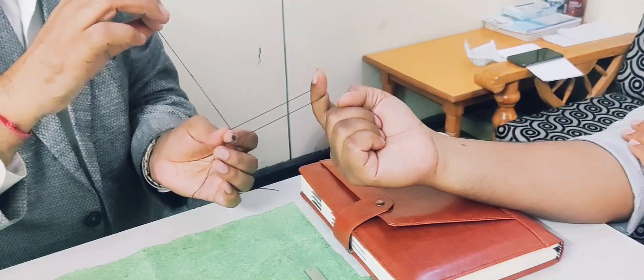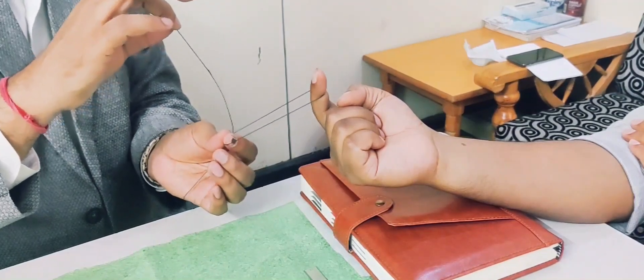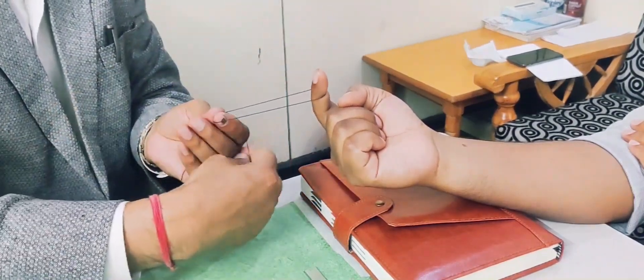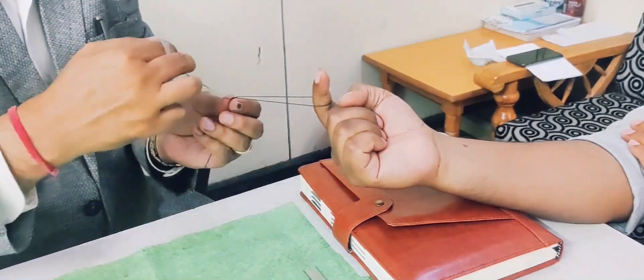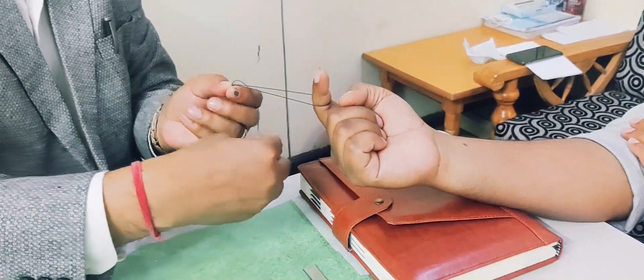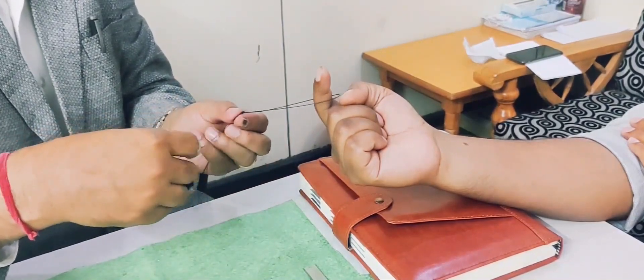Now what we will do? We will do three full turns of these two arms. One, and you can see two, and you can see three.